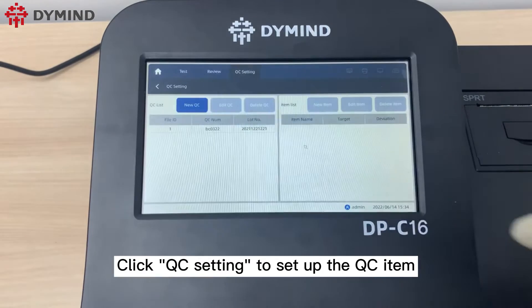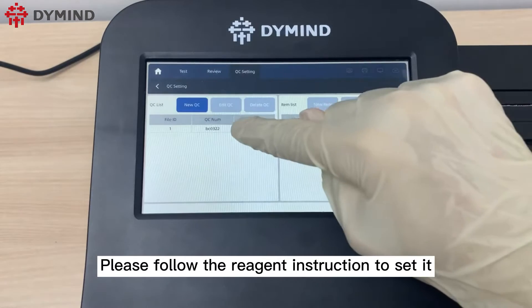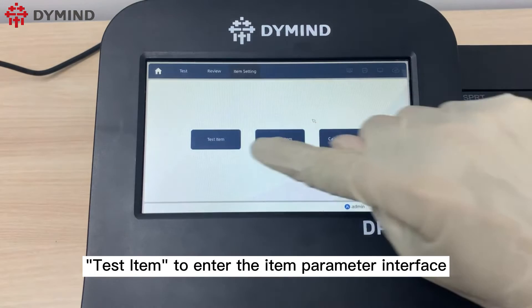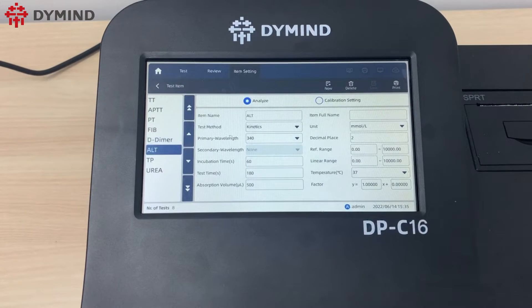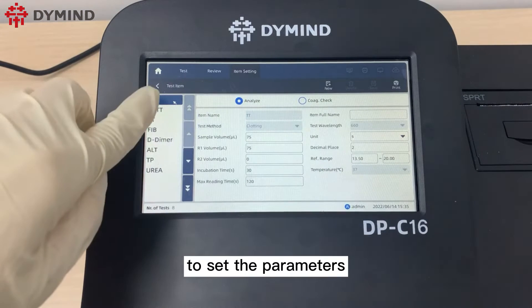Click QC setting to set up the QC item. Please follow the reagent instruction to set it. Click item setting, then test item to enter the item parameter interface. If you have new reagents, please follow the reagent instruction to set the parameters.